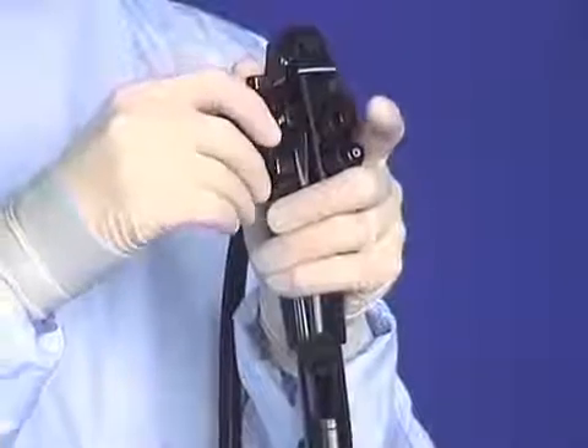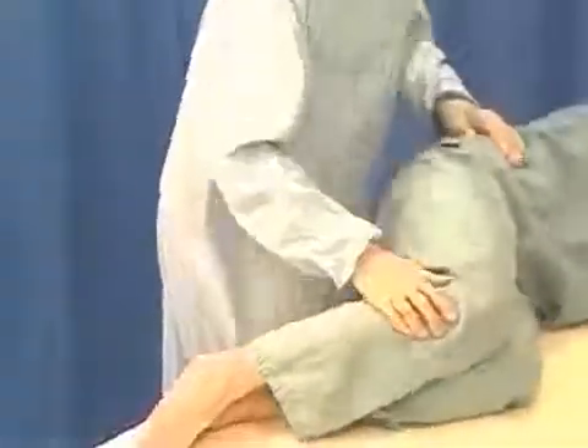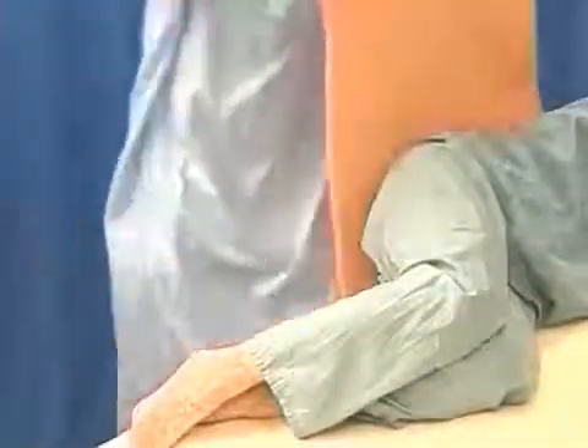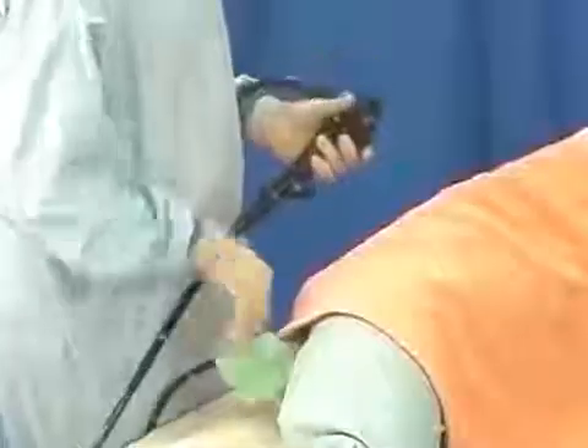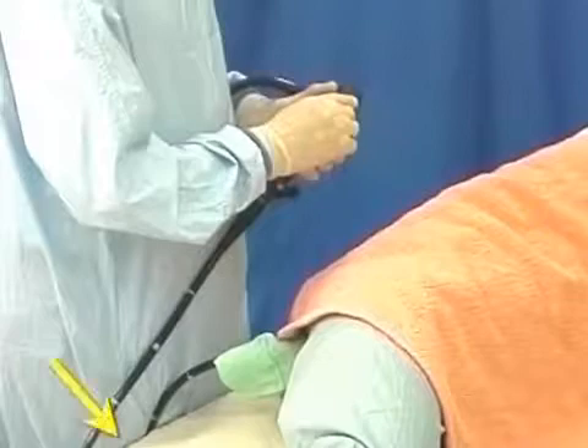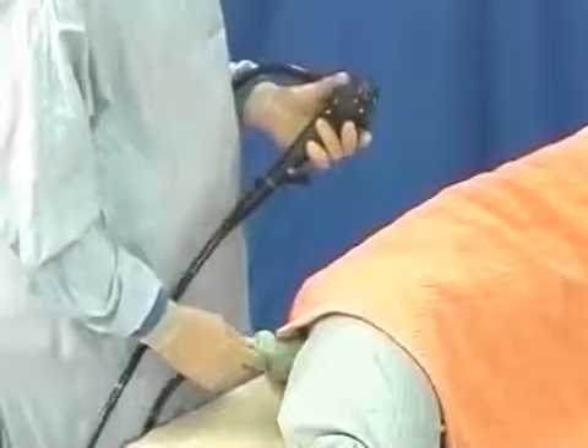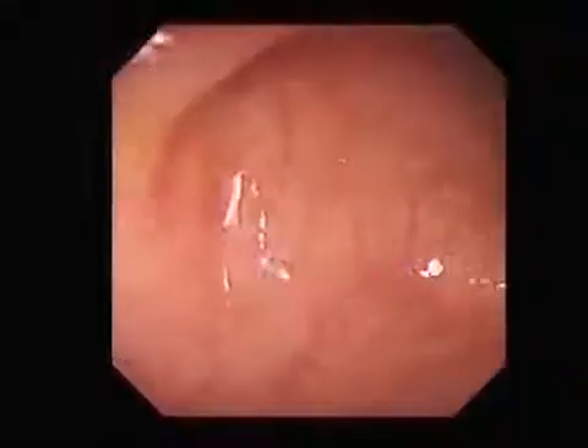For two-handed technique, it helps to position the patient near the edge of the cart or trolley. When the endoscope is inserted, the shaft can be allowed to hang down, and the endoscopist can wedge it in position with the thigh, whilst using the right hand for angulation — for instance, here to the right.